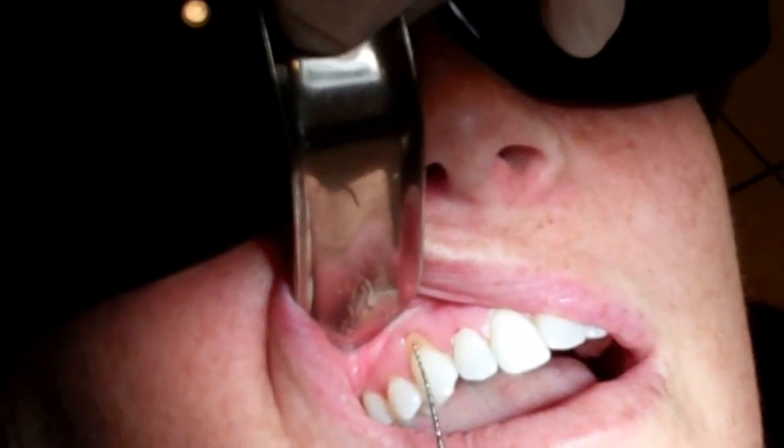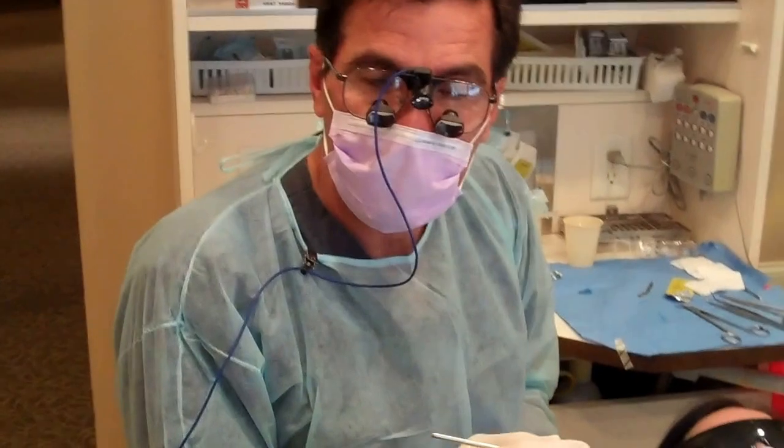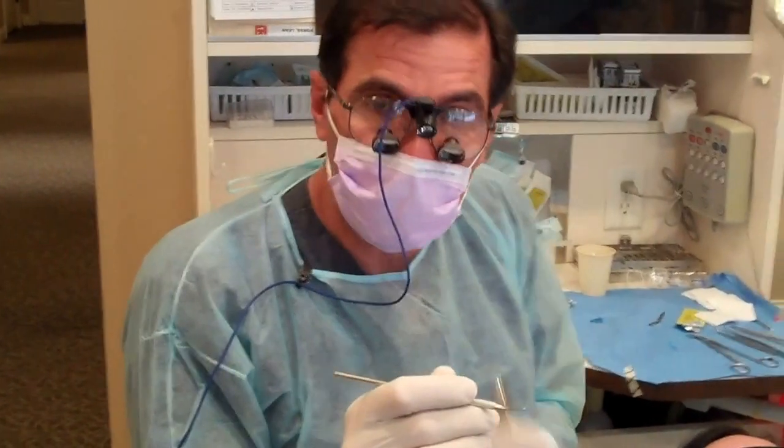So when you see somebody that you're determining whether they would benefit from soft tissue grafting, just measure the pocket, put the probe horizontally, push up and see how much attachment there is. And if there's less than 3 millimeters, then a lot of times you need to really monitor those areas, and something like a connective tissue graft may come in handy, especially if it's a bridge abutment, a partial abutment, or even an implant. We're learning more about that as time goes on.